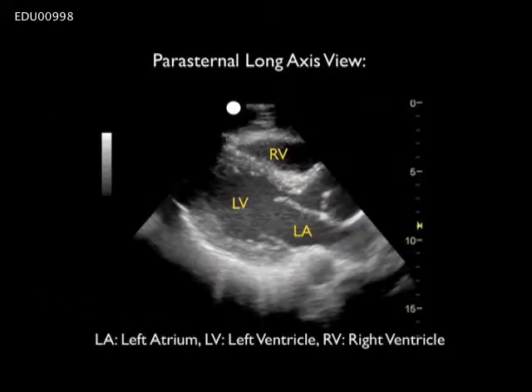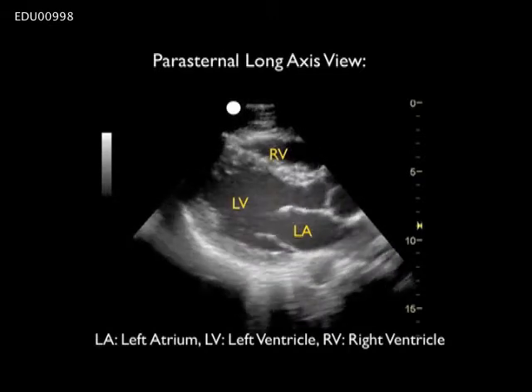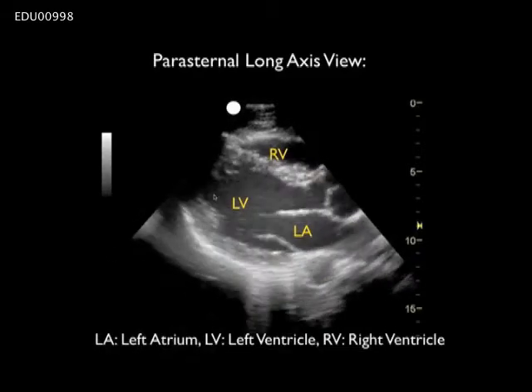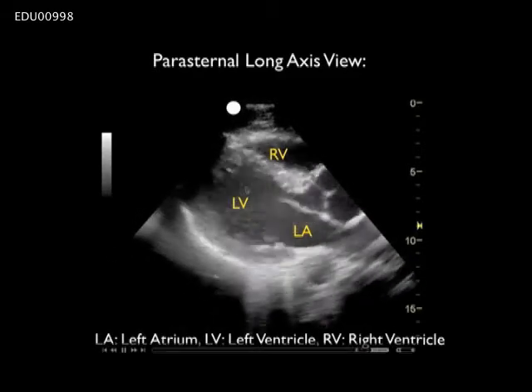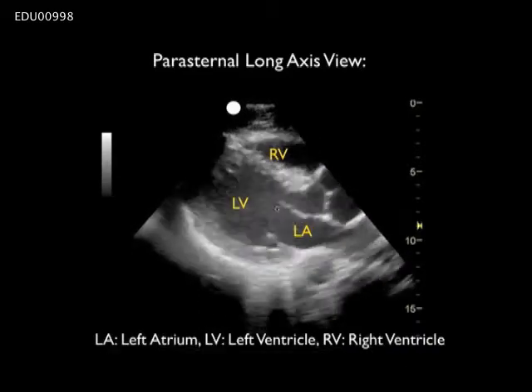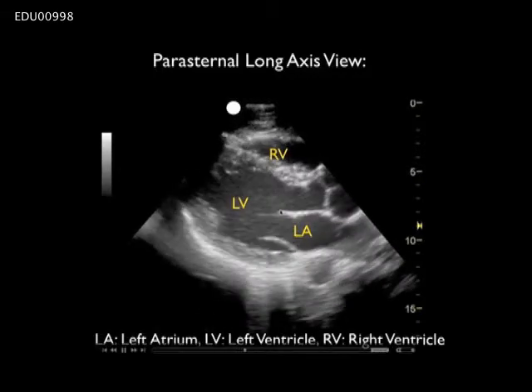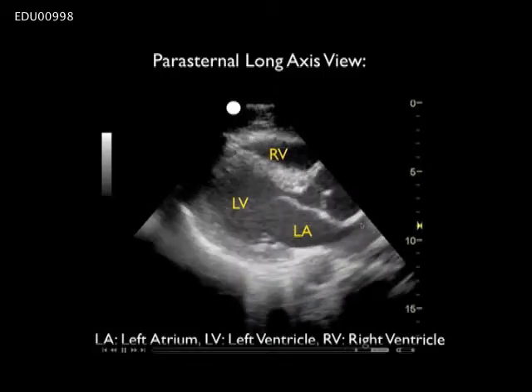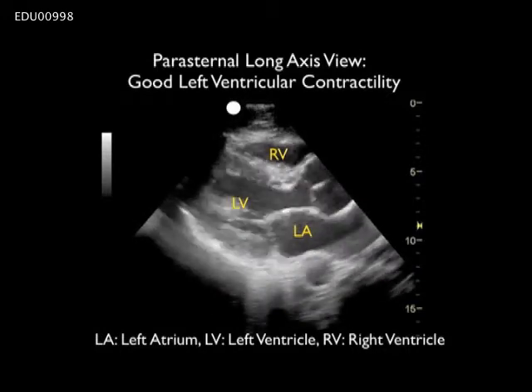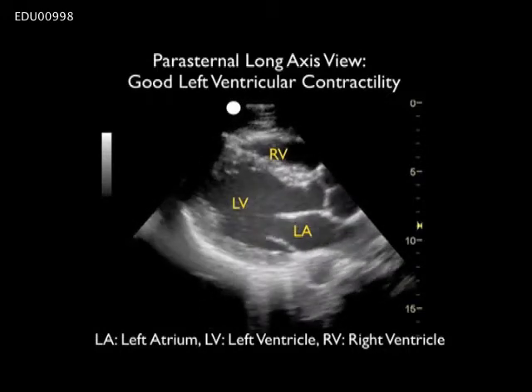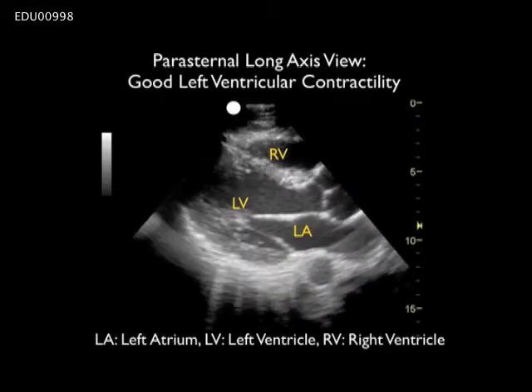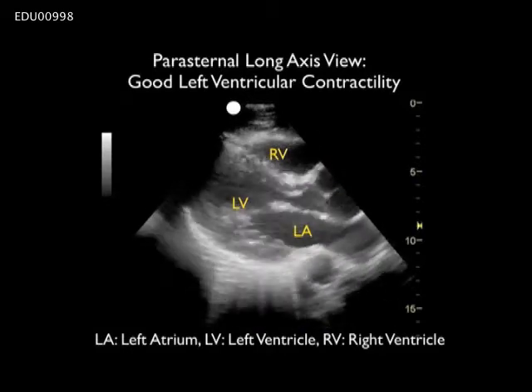The next step in pump evaluation is to determine contractility of the left ventricle. Here we see the three main chambers from the parasternal long axis view: the right ventricle, left atrium, and left ventricle. Notice that during systole the endocardial walls of this left ventricle almost close down completely, indicating excellent contractility. We can also see that the anterior leaflet of the mitral valve flips open and almost slaps up against the septum with each heartbeat, again indicating good contractility. If this patient was hypotensive, we could give quite a lot of fluid before causing pulmonary edema.